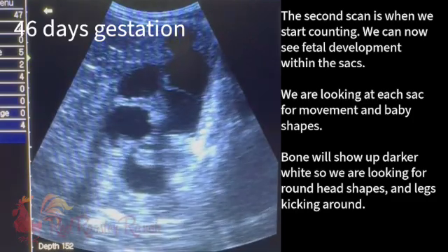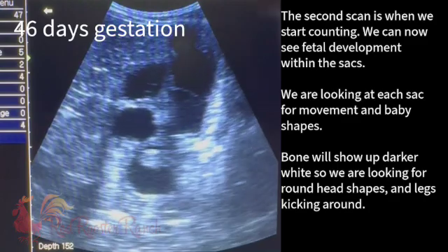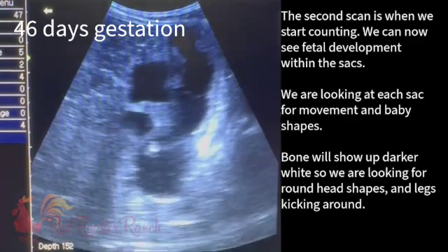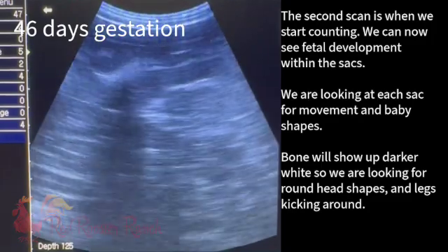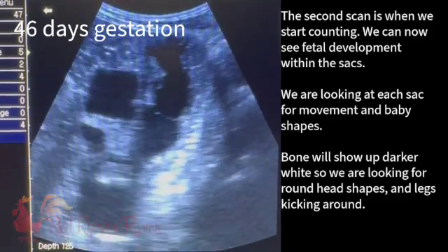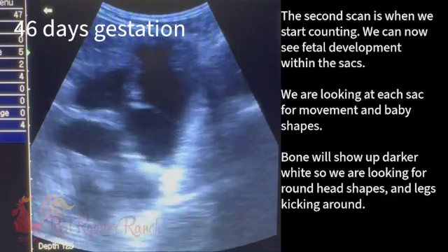So if I was just counting sacks, I would think I see five sacks — one, two, three, four, five. And that's definitely not the case. There's not five babies. I think there's three.